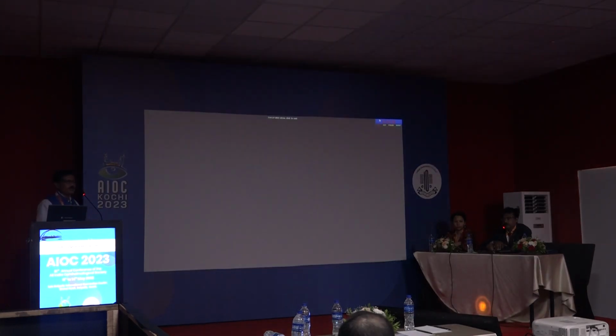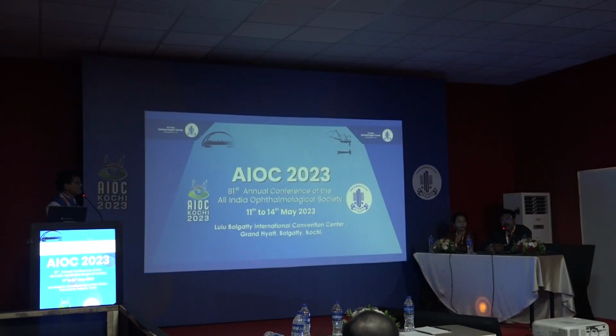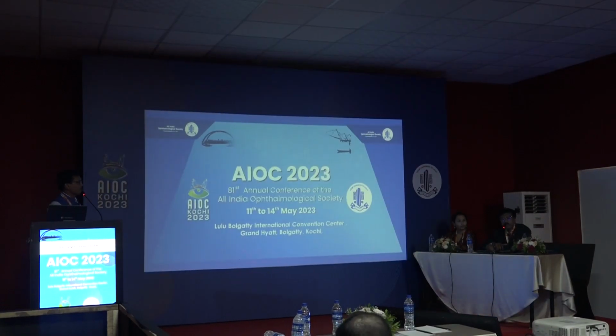So thank you. I tried to do some justice to this very vast topic in these 15 minutes. Actually, it's a very good talk, and always think about that. IOL power calculation is not the optometrist's job. So doctors should know the biometry. Suppose a patient with an abnormal power comes to you for the operation, you should check that abnormal power when prescribed by the optometrist. The doctor should check, recheck, then apply the power.